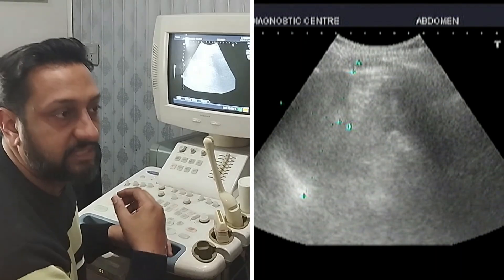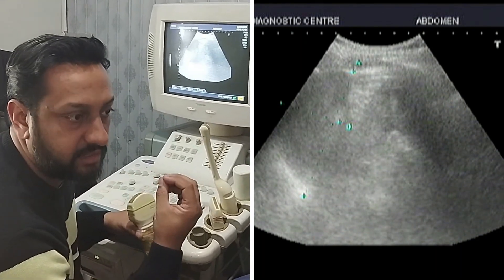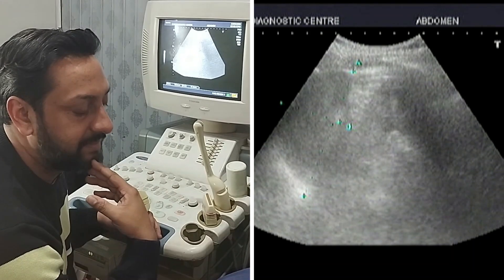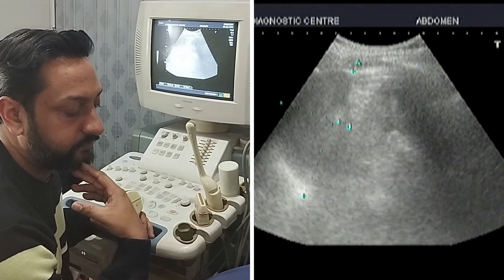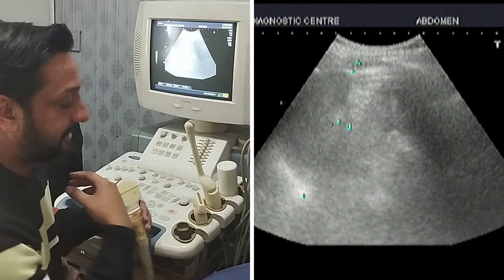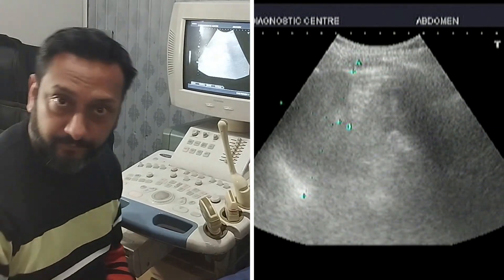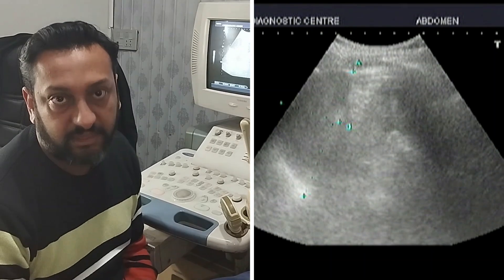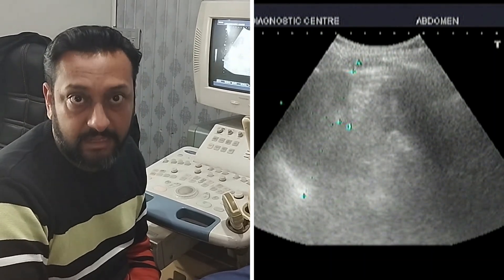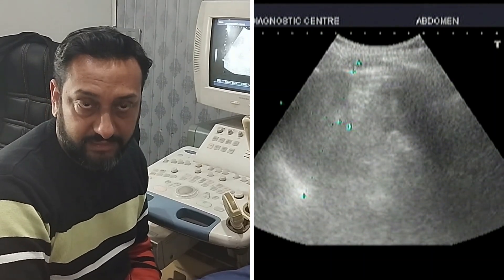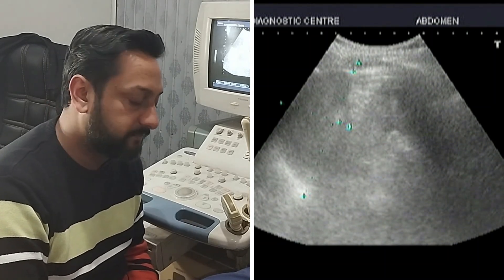The normal length of the spleen should be less than 13 cm in an adult at its maximum dimension. The other thing we should be measuring is the splenic index. To measure the splenic index, I will multiply the length of the spleen by the width of the spleen, and the value I get is the splenic index. The splenic index should be less than 45 cm² in a normal individual.